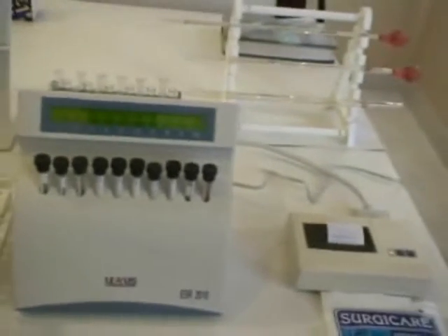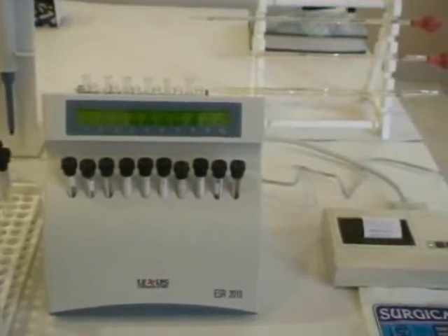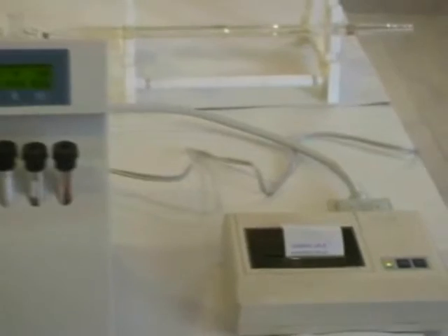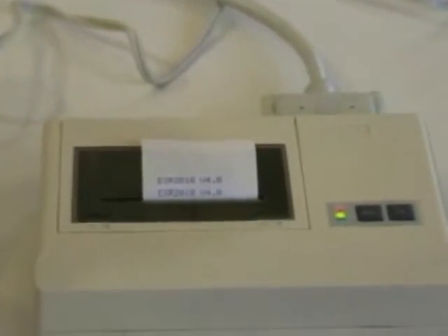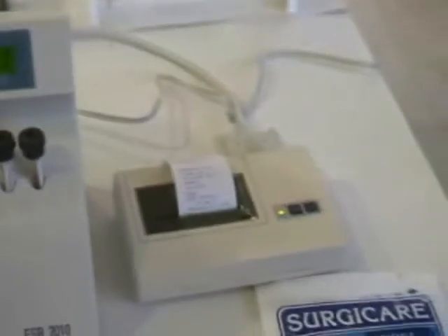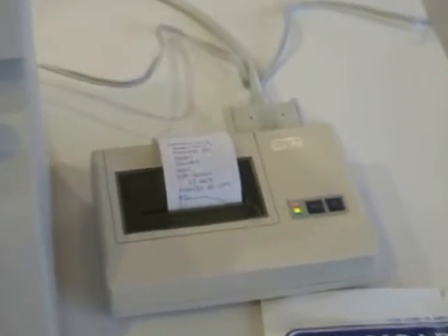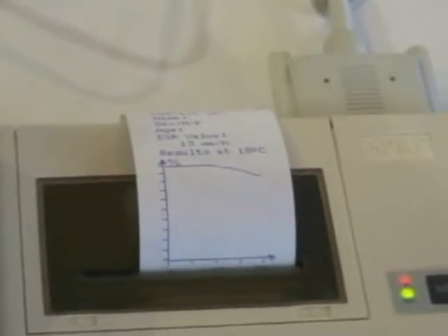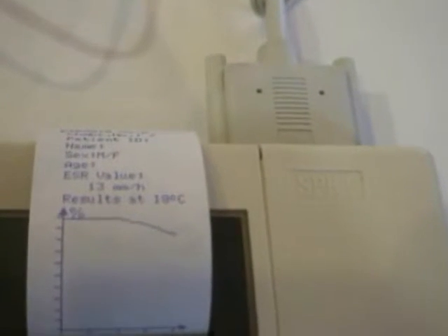At the end of 30 minutes for the first test at chamber number 7, the result is displayed on the LCD. Simultaneously the result is also obtained in the printer in the form of a graphical representation. The printed result features the chamber number, the ESR results at 18 degrees Celsius with the result kinetics in the form of a graph.